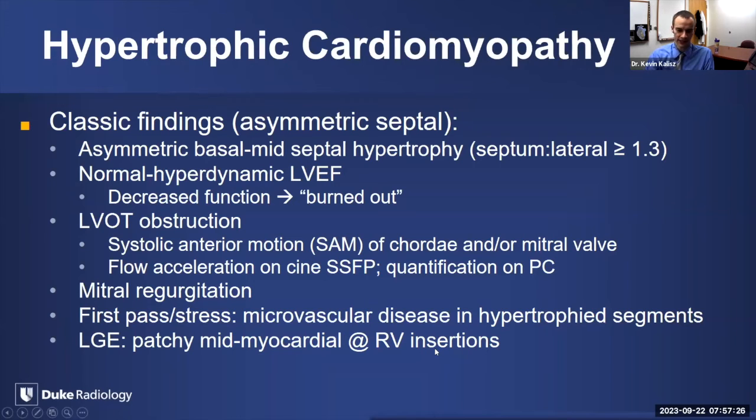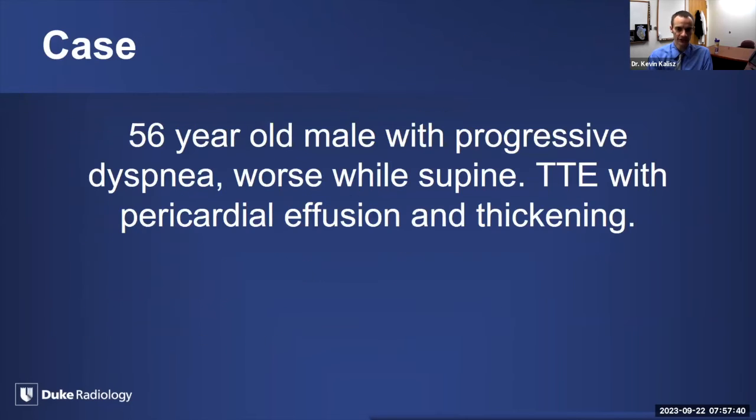I know the guidelines on HCM therapies are evolving, especially here in the States. But I can foresee in the near future LGE potentially playing a larger and larger role for AICD selection in these patients. So certainly LGE is something to comment on.